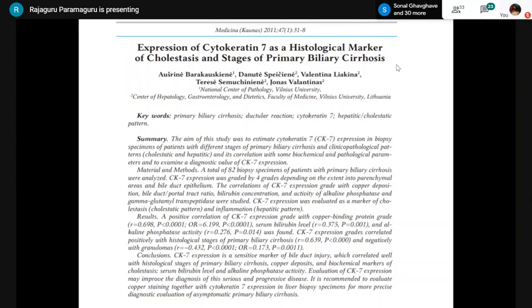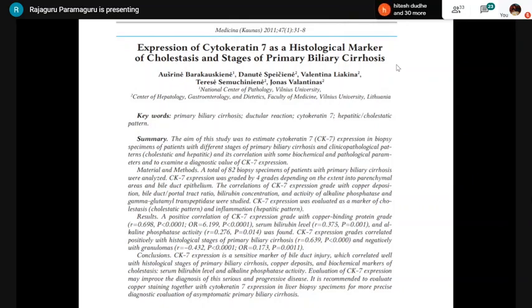In a cirrhotic patient, when trying to differentiate biliary cirrhosis from other pathologies, CK7 clearly highlights the periportal hepatocytes, indicating bile duct-related disease. Note that autoimmune hepatitis can also show some CK7 staining, so it is less discriminatory in that context.